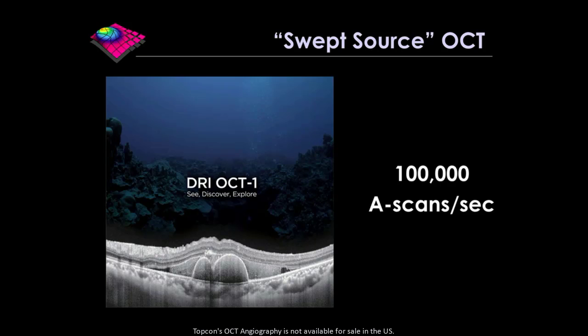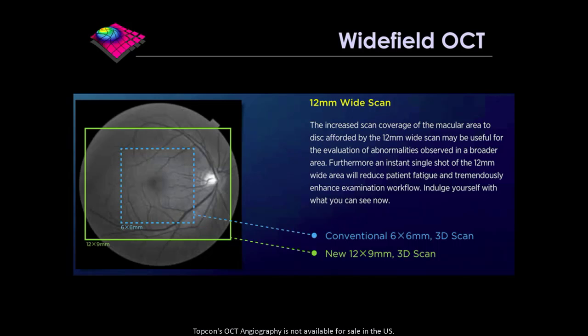Because it being fast by itself isn't really useful. It's like saying your computer is 2.7 gigahertz. That's only useful if it allows you to do better things, and it changes the way you diagnose and manage your patients. And I think that this does. Now, in particular, I think it's us taking our first fledgling steps into the world of wide field OCT.